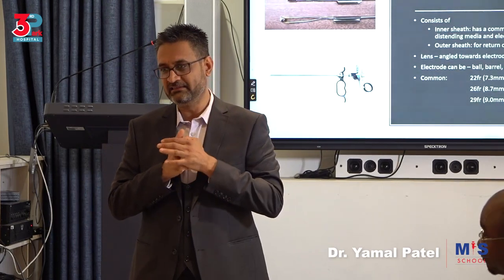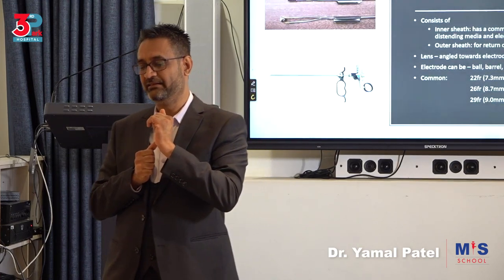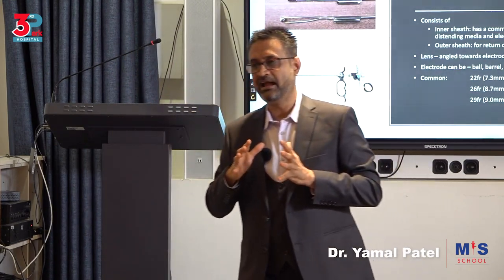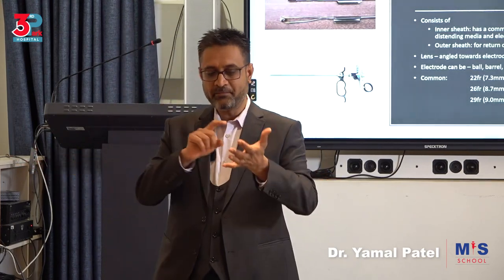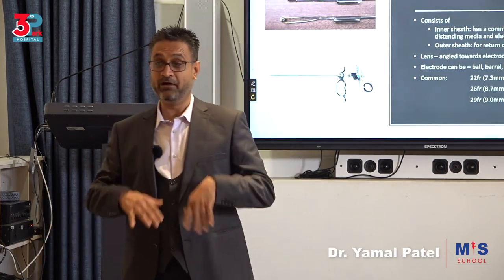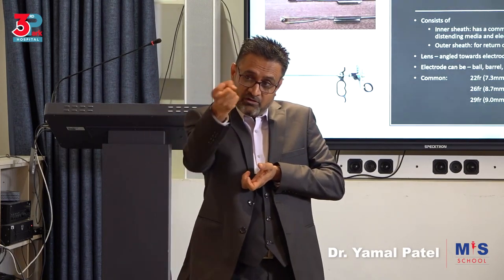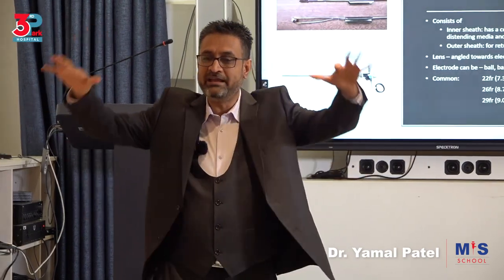That's the most common answer that people give. It's wrong. That's why I'm trying to explain. Okay, what did I just say about the electricity and electrolytes? It disperses it, right? So remember what I said, fine in, burn, broad out, no burn. Now here, you're in with an electrode with a fine tip where you're going to try and burn something on the uterus, but then all surrounding it is what? Is saline, which has lots and lots of electrolytes.